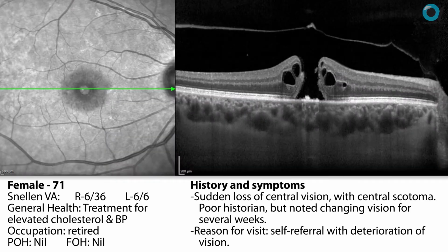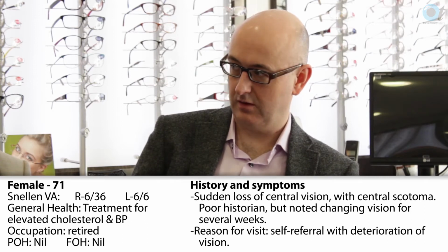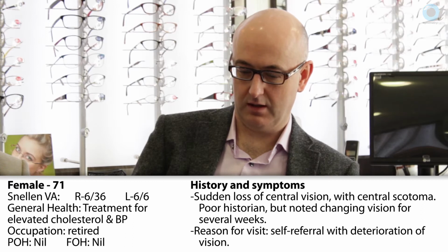If we have a little look at the OCT images, would somebody like to give their thoughts on what's going on here? It looks like a full thickness macular hole, perhaps secondary to vitreomacular traction, which would certainly account for the poor vision in the right eye. Right. Do you think that might also account for the suddenness of the loss of vision and the further deterioration? I think it could explain that. If the traction was happening, then that could cause a gradual escalation of visual changes, and then when the full hole develops, then that accounts for the sudden loss.